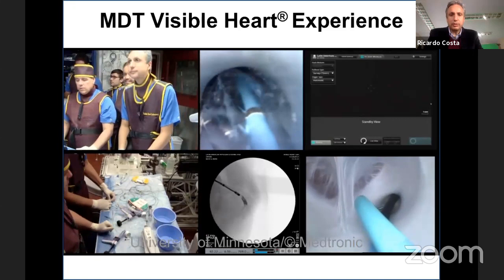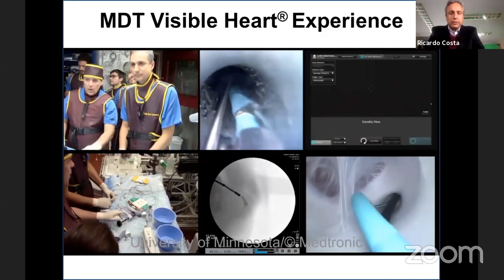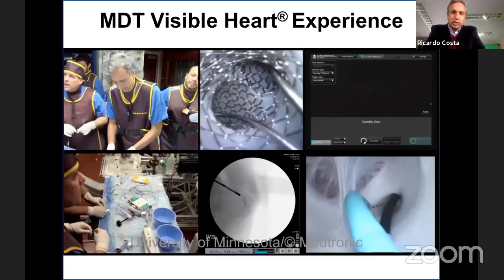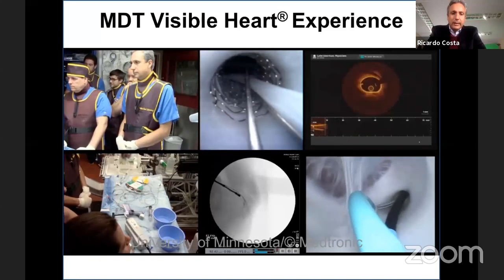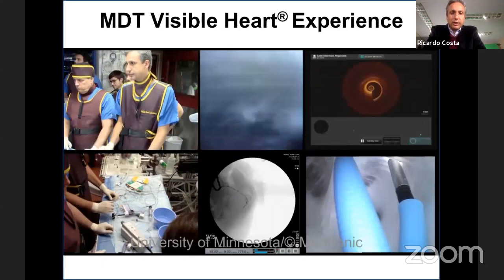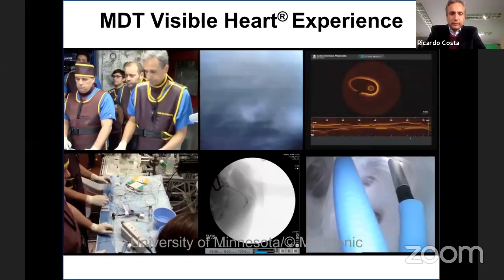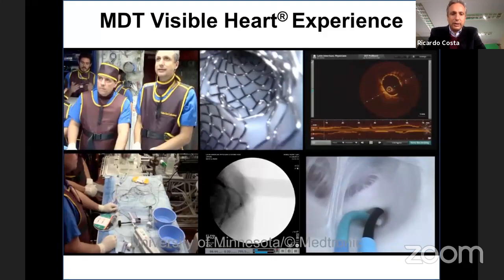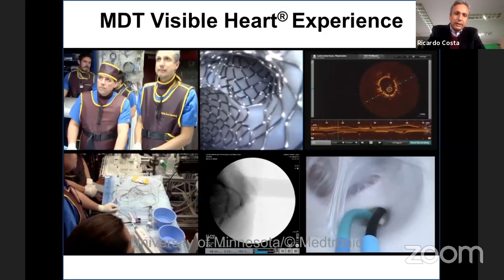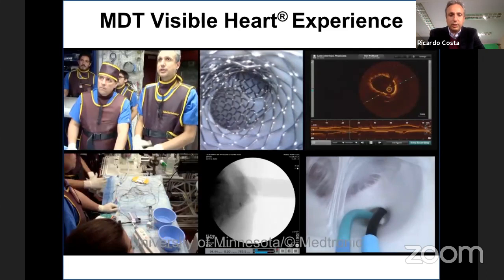And we just come here to the end. I'll just highlight the type of reconstruction that you see: the complete absence of any distortion, any excessive crushing or metallic crushing here, or distortions at this segment, the full expansion of both branches, and especially the ostium on the side branch. So this is the image here. How we can see this is like a regular stent that we use in clinical practice. And I think it's a good understanding of this technique.